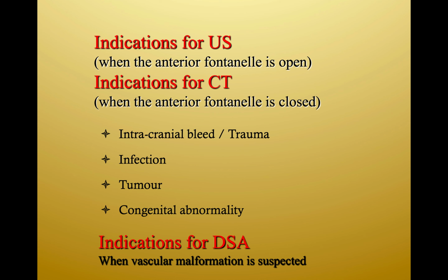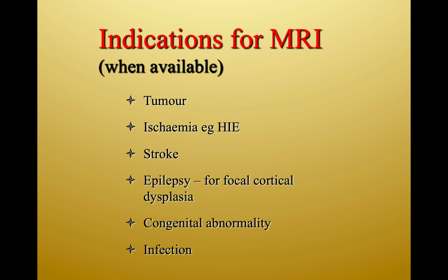But you do have MRI to complement that, especially in cases that are not urgent, where you can schedule the appointment. And diagnostic digital subtracted angiography, DSA, is reserved for cases where we suspect a vascular malformation, for example an arteriovenous malformation. So what about MRI?